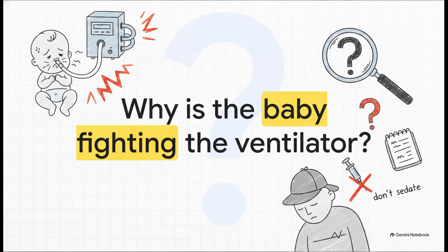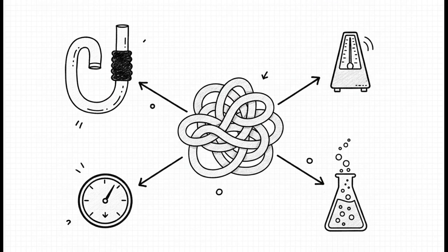But hold on, we need to act as detectives here. Why are they fighting? If you just sedate them without looking for the why, you risk causing their entire respiratory effort to completely collapse. So here's your troubleshooting checklist.